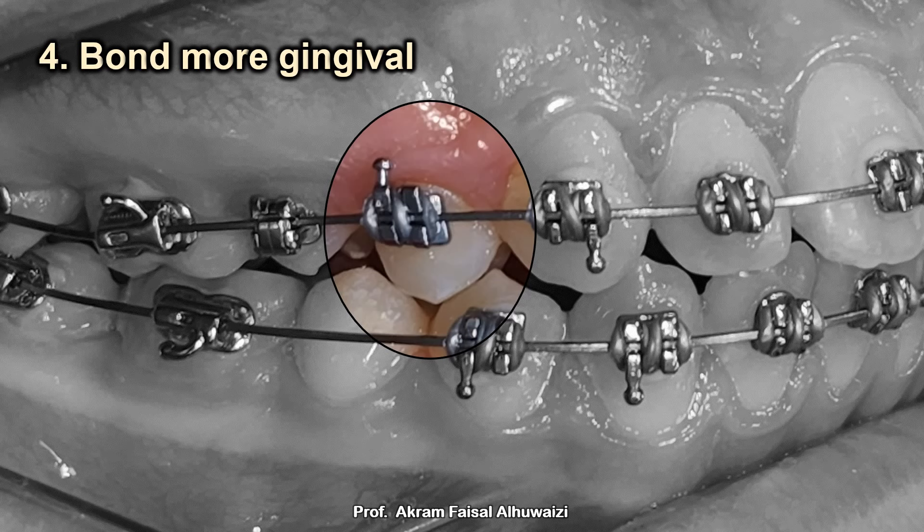Tip number four: bond the upper four more gingivally. As you bond the upper four gingivally it's going to extrude, which makes its extraction much easier — especially since the upper four has two roots, sometimes with very fine-tipped roots prone to fracture during extraction. As it extrudes you may get some cuspal interferences with occlusion, so just grind that cusp so it doesn't become traumatic.